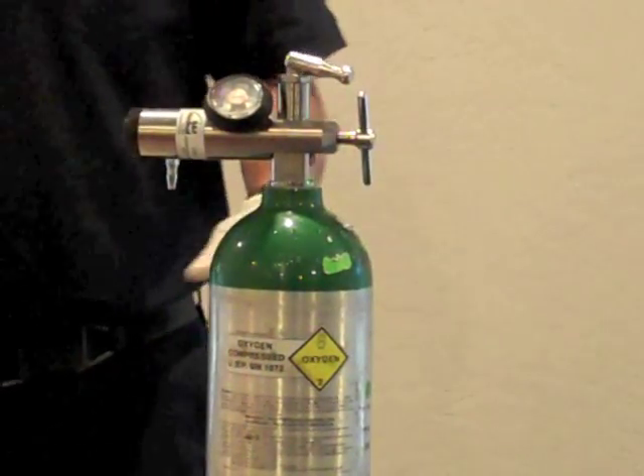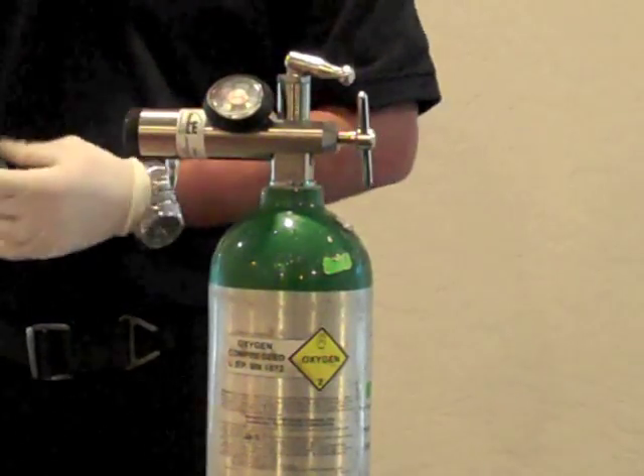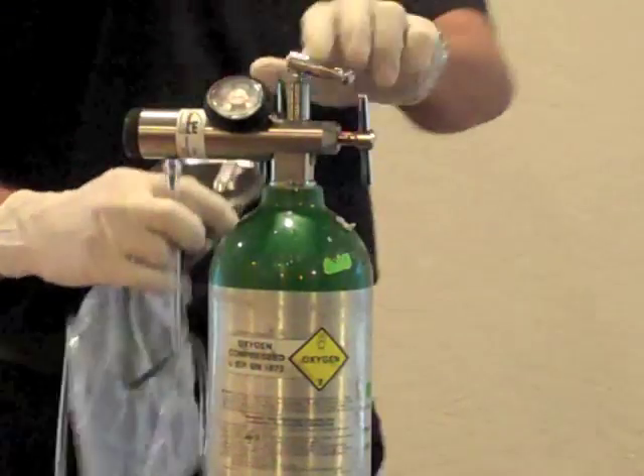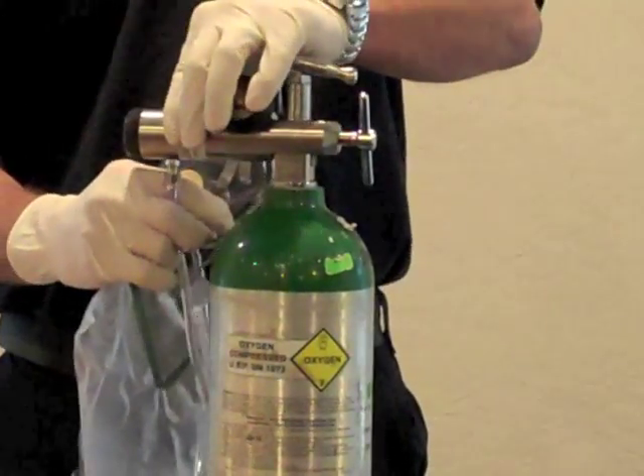Turn the oxygen bottle on and ensure that there is enough pressure in the tank to deliver the oxygen that is required. Take the oxygen tubing on the non-rebreather mask and attach it to the regulator.